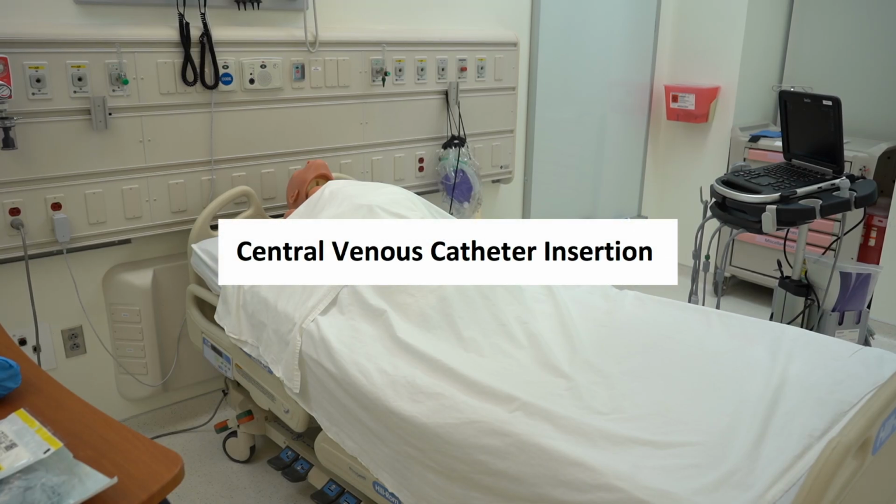Hi, this is Pete Miliaris of VCU Health, and in this video we're going to discuss central venous catheter insertion in the internal jugular vein. While the concept of technical steps for most central venous catheter insertions are the same, they do differ on target vessel and catheter type utilized.